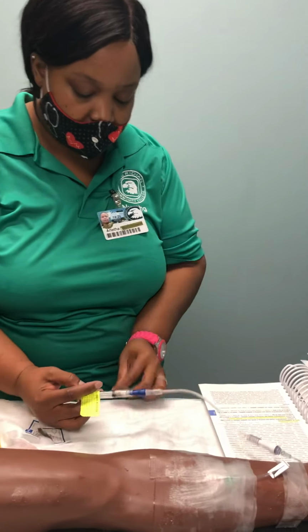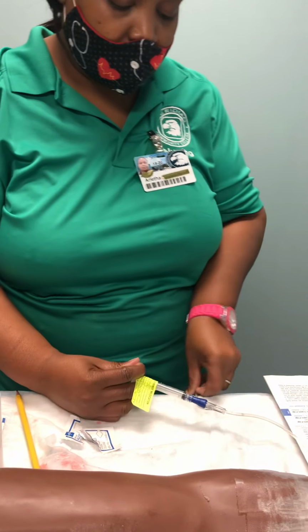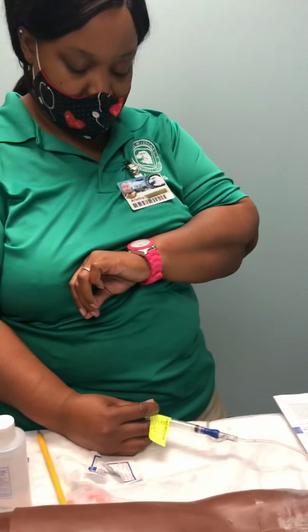Okay, I'm going to get my other 1 milliliter, clamp, and push. Unclamp, and start my 2.5 minutes.